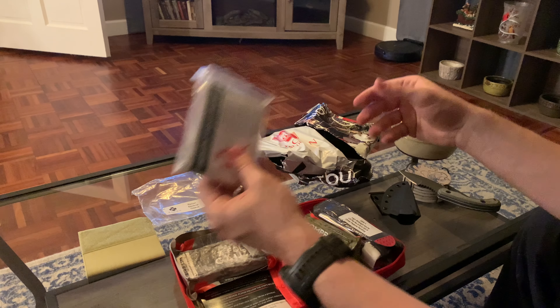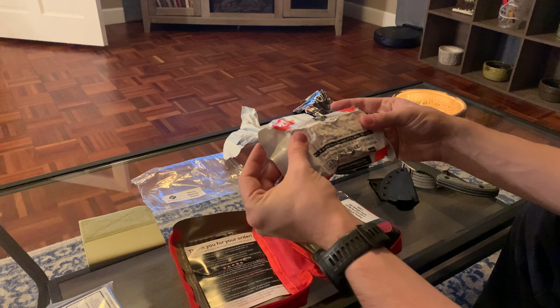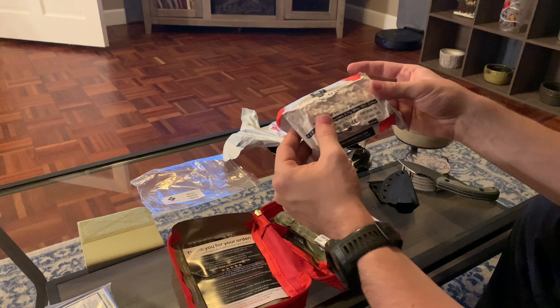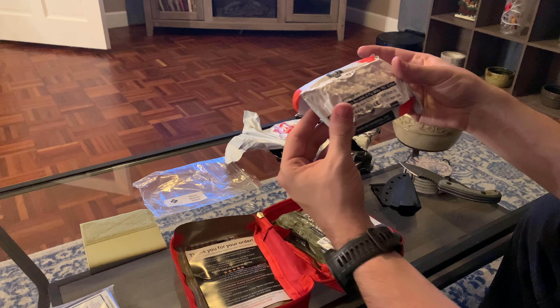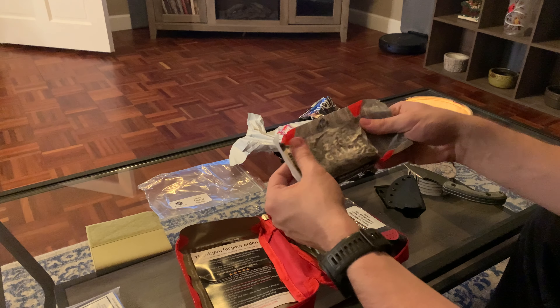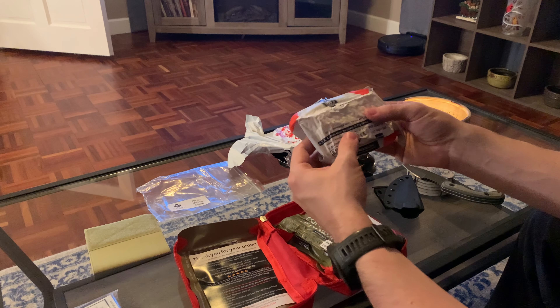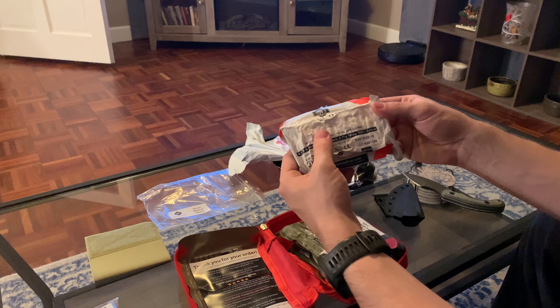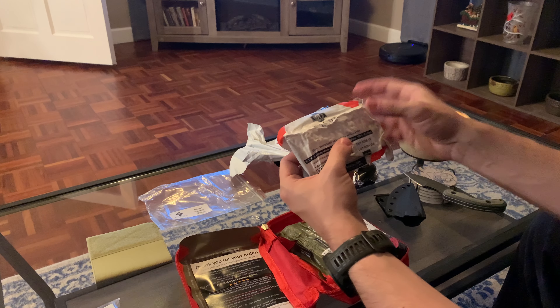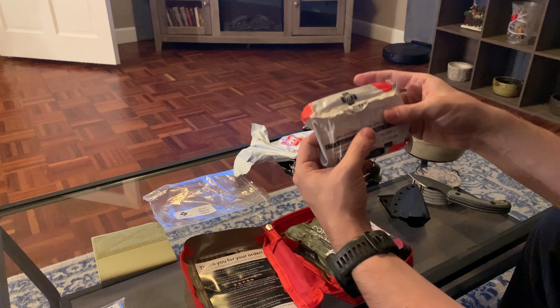We got a rescue blanket — emergency rescue blanket, waterproof, windproof, compact, lightweight design, retains body heat, non-toxic, reusable material. These are really good, especially if you have a really deep laceration, cut, or a gunshot wound — you can go into hypothermia and it can end really bad. So this is something really good to have in any kit. It will save your life if you need it.